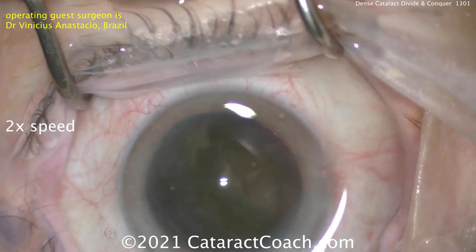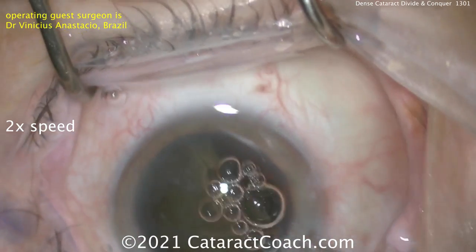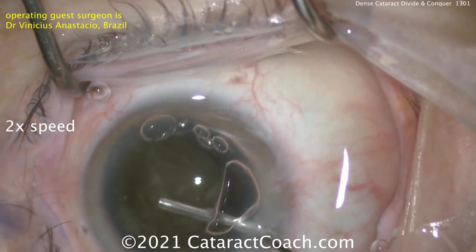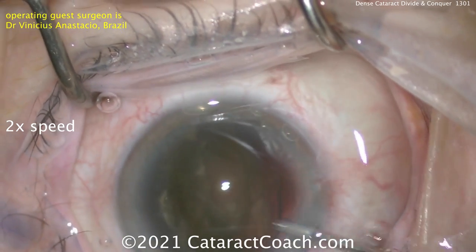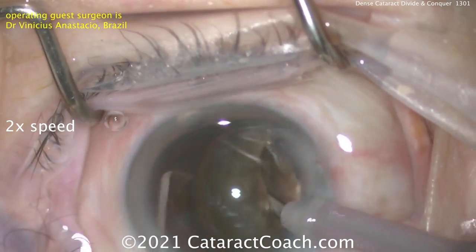Going back inside the eye — what is he going to do now? Of course, more dispersive viscoelastic. Protect that cornea. You know that viscoelastic is cheaper than vitreous. And here's another secret: viscoelastic is also cheaper than corneal endothelial cells.